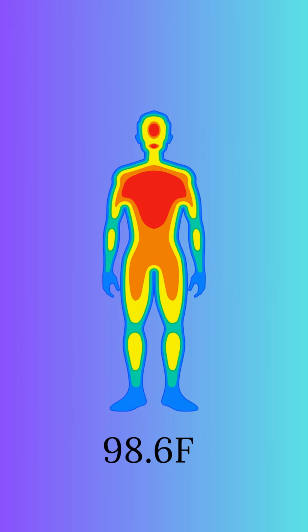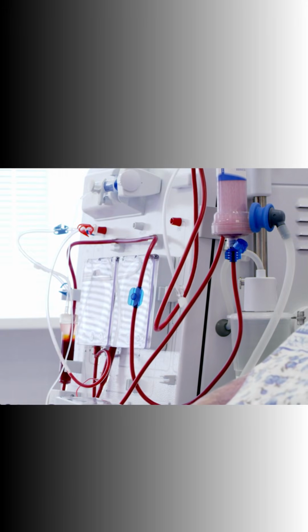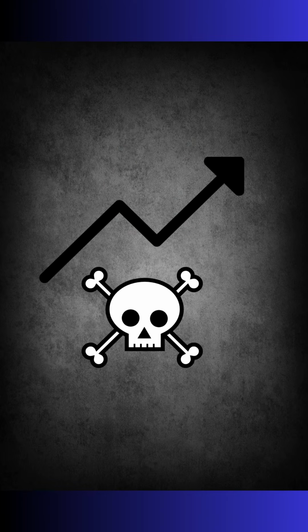Body temperature is strictly regulated around 98.6 Fahrenheit. During CRRT, blood is being removed from the body, run through a machine at room temperature, and returned to the body, all of which drops the temperature of blood. In a patient who is already very sick, hypothermia can increase oxygen requirements, cause arrhythmias, and ischemia. Overall, it increases morbidity and mortality.